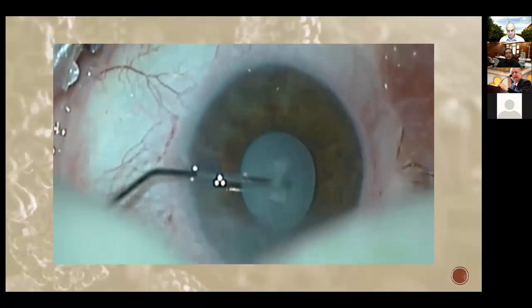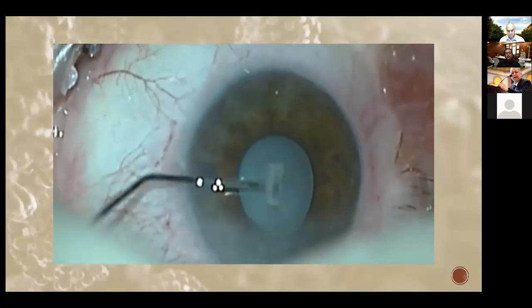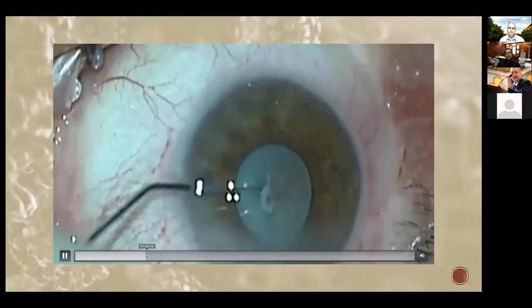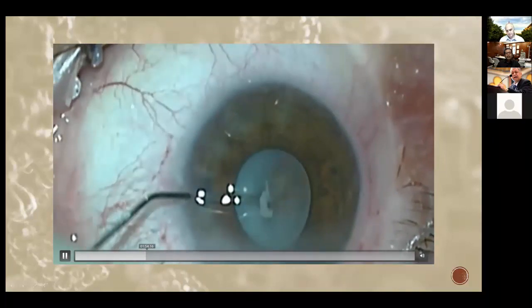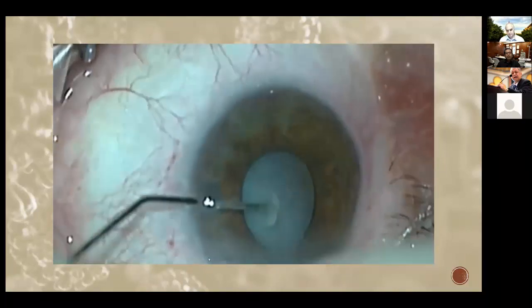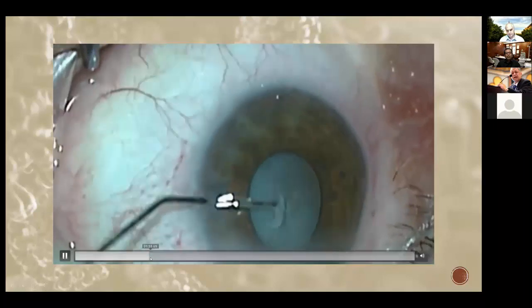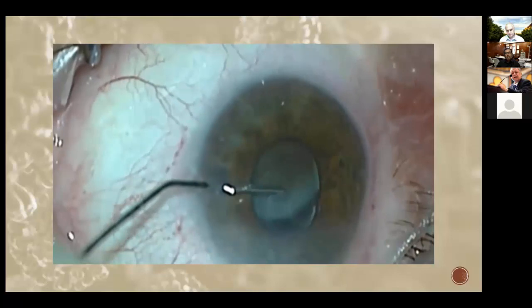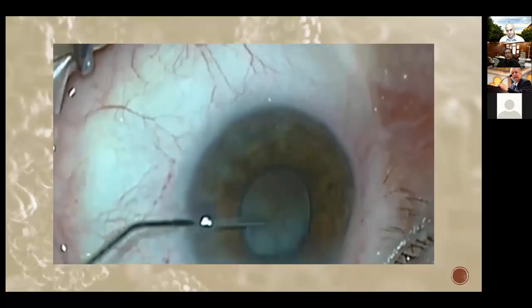And once it clears, you can see the surprise. A very, very hard nucleus. Small, very small, no cortex, no epinucleus, nothing.